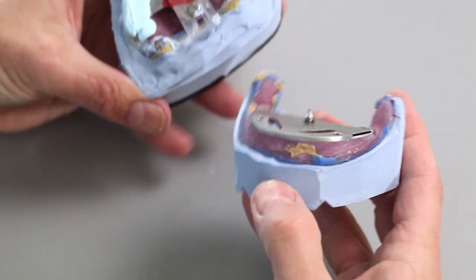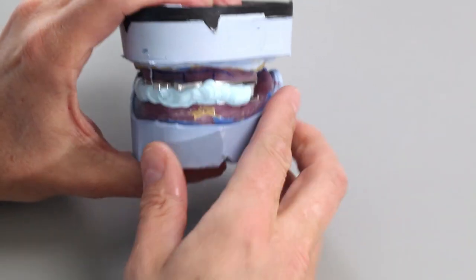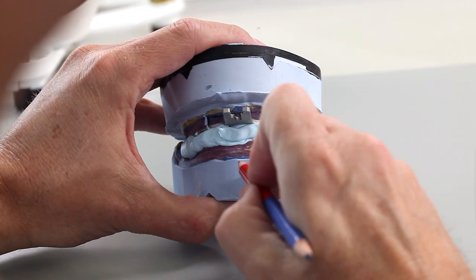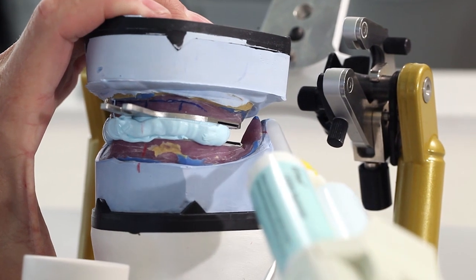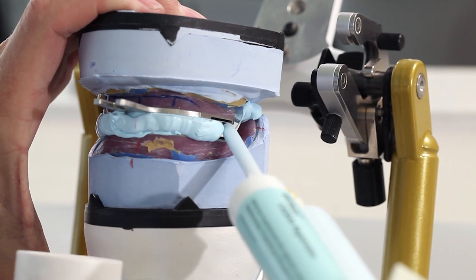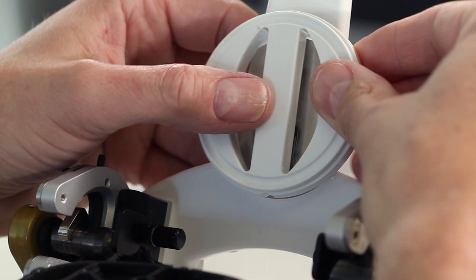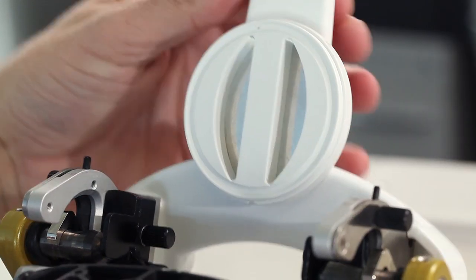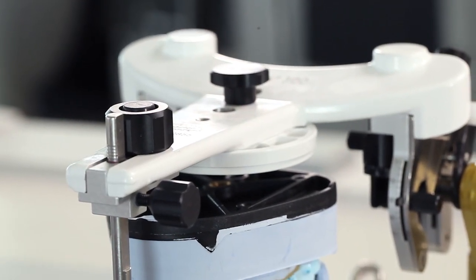Position the mandibular model with the support pin in centric position on the upper bite registration. Combine the models until the mandibular model contacts the silicone key. Transfer the aesthetic midline marked by the clinician to the mandibular model. If the models fit into the registration without any problem, secure them in this position. Mount the maxillary model in this position using the magnetic base block. Articulation is done in the conventional manner with or without a split cast system.